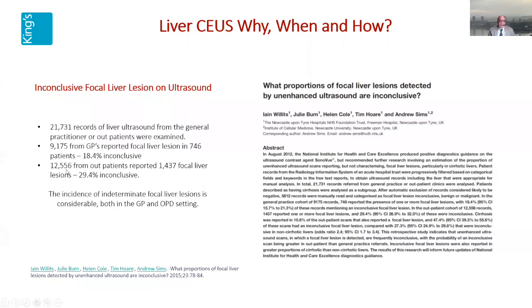inconclusive. From outpatients, 12,500 patients, 1,437 focal liver lesions were seen, of which nearly 30% were inconclusive. So the incidence of indeterminate focal liver lesions is considerable, both in the GP and the outpatient setting. So you're going to see quite a number of indeterminate focal liver lesions.